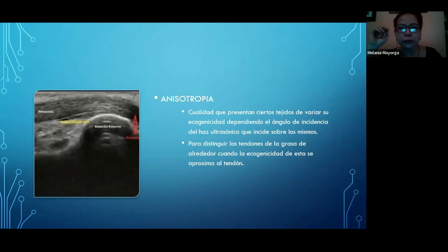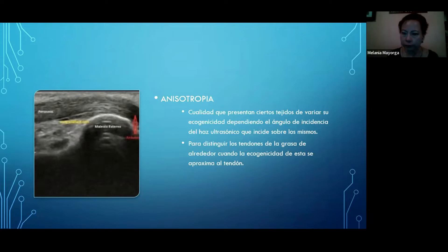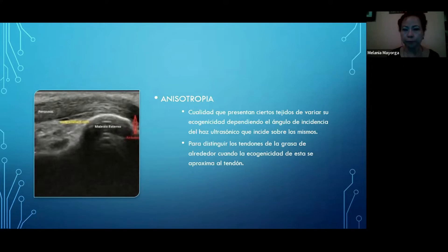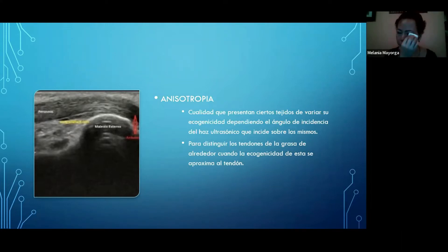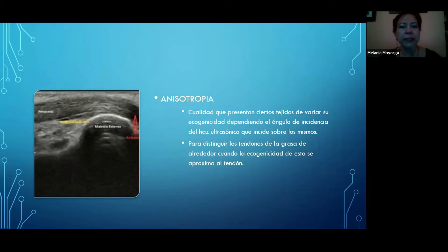Como tenemos varios tipos de ultrasonidos, tenemos también la anisotropía, que va a ser la cualidad que presentan ciertos tejidos. Debemos variar su ecogenicidad dependiendo del ángulo de incidencia del haz ultrasónico que incide sobre los mismos. Principalmente a nivel de tejidos musculoesqueléticos, como lo vemos en el caso de la imagen, donde estamos viendo un tendón que nos va a causar anisotropía y lo vamos a ver con sus fibras normales.